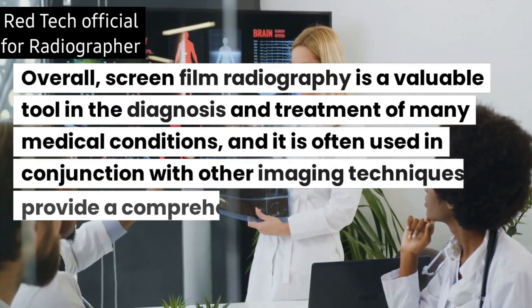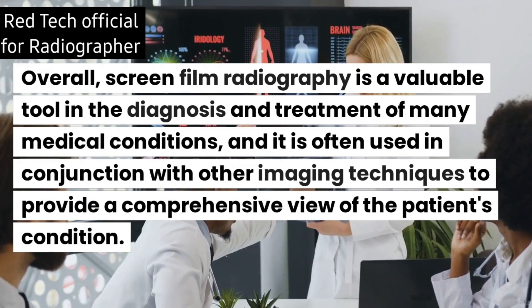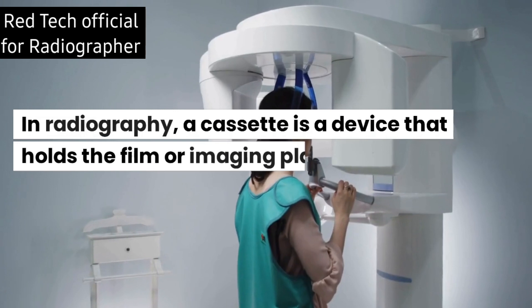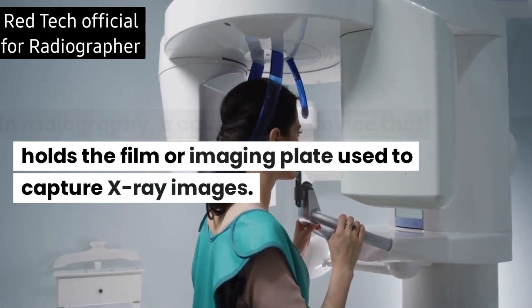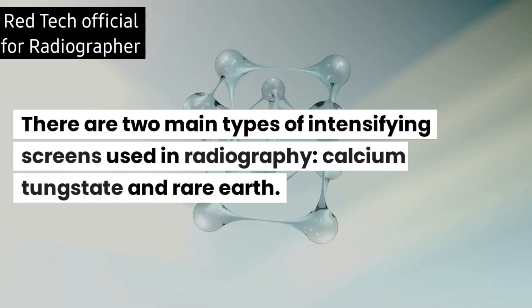Welcome to Red Tech Channel, a new way to learn. In this video, I am going to discuss screen film radiography, including topics like cassettes, intensifying screens, and x-ray film. Screen film radiography is a diagnostic imaging technique that uses x-rays to produce images of the internal structures of the body. A patient is exposed to x-rays which pass through the body and are captured by a film coated with a special material called a screen, which converts the x-ray energy into visible light to produce an image.